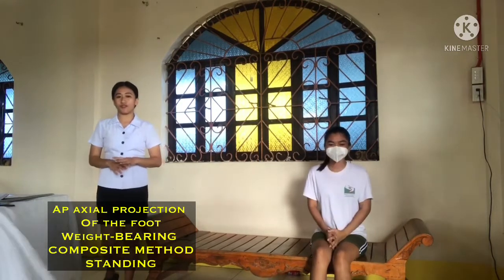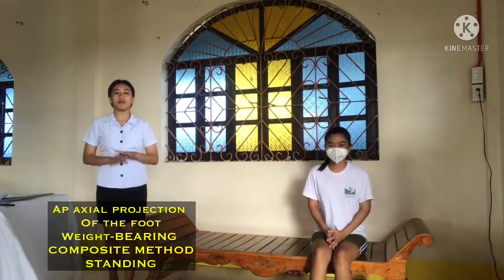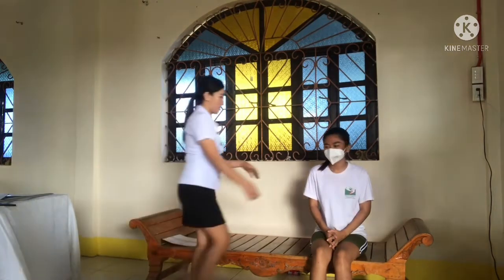So, next we have the AP axial projection of the foot, weight-bearing composite method standing. So, the IR used must be 24 by 30 cm lengthwise. So, place the patient in standing position, standing upright position.